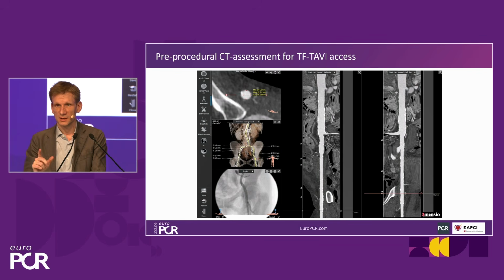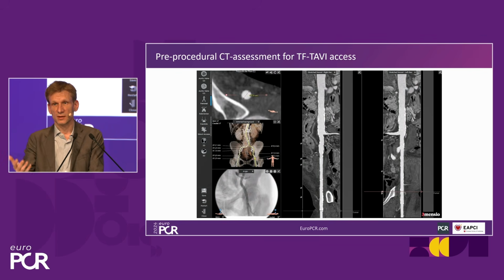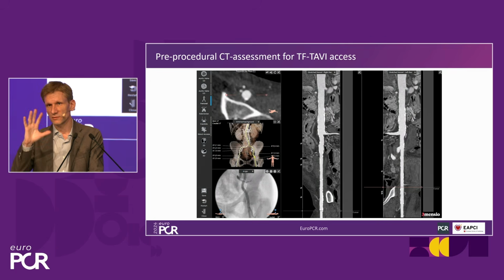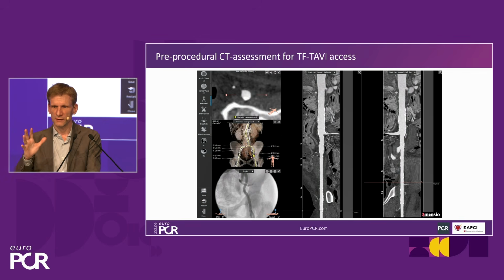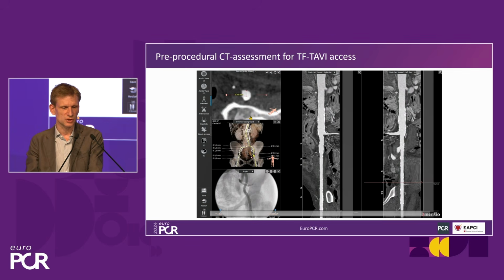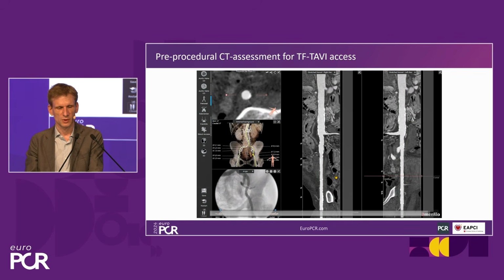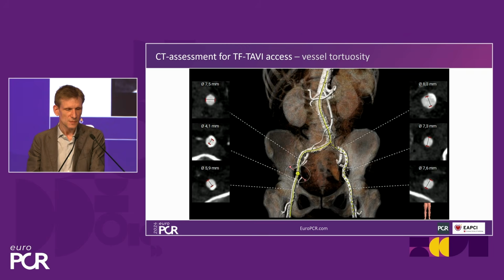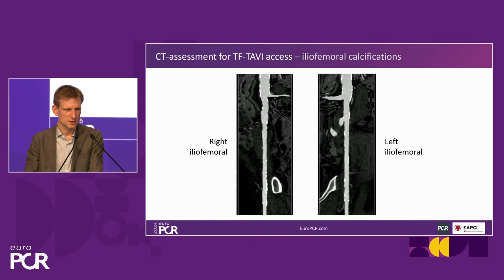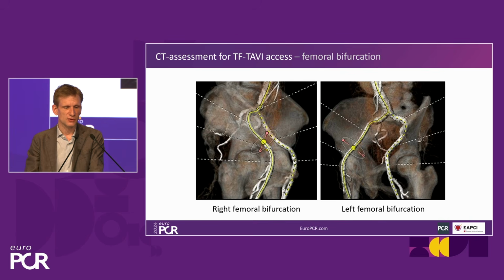So on CT, I see many people starting a TAVI who look at their CT very much just for the valve, and they have a very quick view of the access. I spend more time, to be honest, and I really inspect my puncture site and try to find out what would be my best puncture site. So you get this information almost for free on your CT. That's what I demonstrate here. So we inspect this. I turn this model.